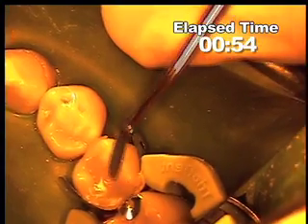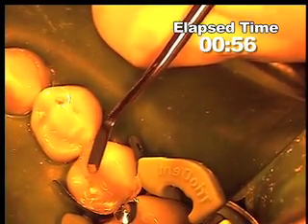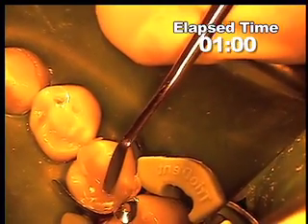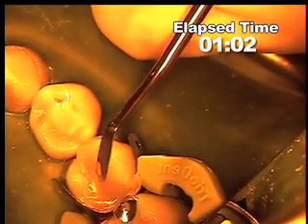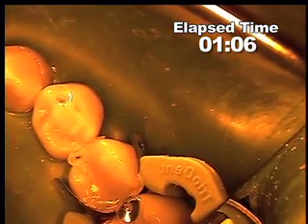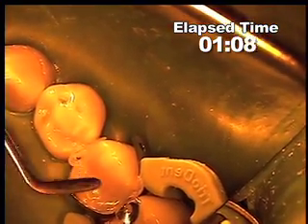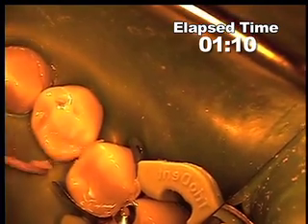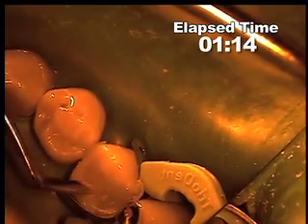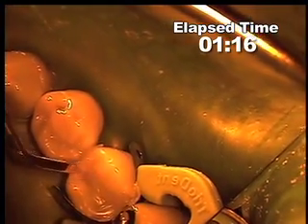What I really want to point out here is the fact that the material at this point has not returned all the way to its uninitiated state. Easily carvable, very easy to work with and shape, and so basically there it is.